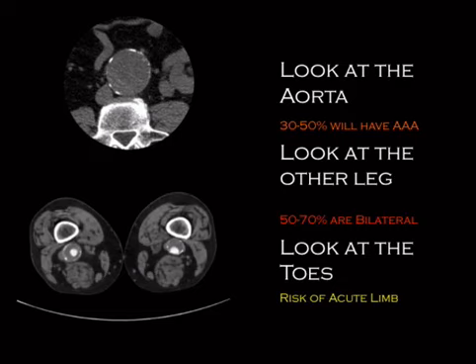So if you were reading this study and you didn't mention that, you can be sued for lots of stuff. Obviously, you can be sued for putting your name on a report, basically. But you would be more likely to be sued if you did not mention the popliteal artery aneurysm, the saccular one, and they ended up having a threatened limb later on or lost their toes, because they're at high risk for embolic disease in the setting of an aneurysm, which makes perfect sense when you look at it.